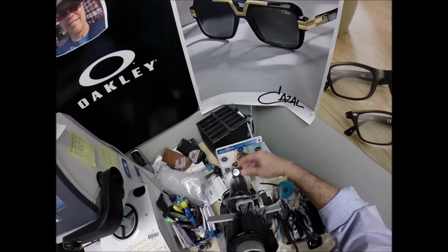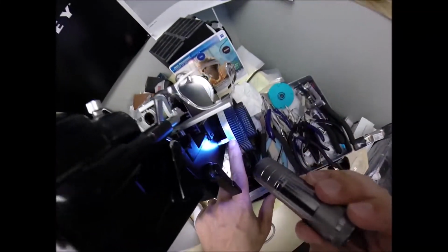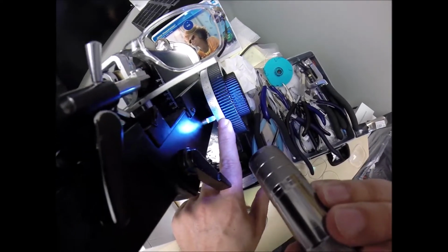We're going to turn the axis wheel back to 2, check the power of the lens, and I am getting -1/4. You don't believe it's -1/4? Look, there's the minus symbol right there in the red.